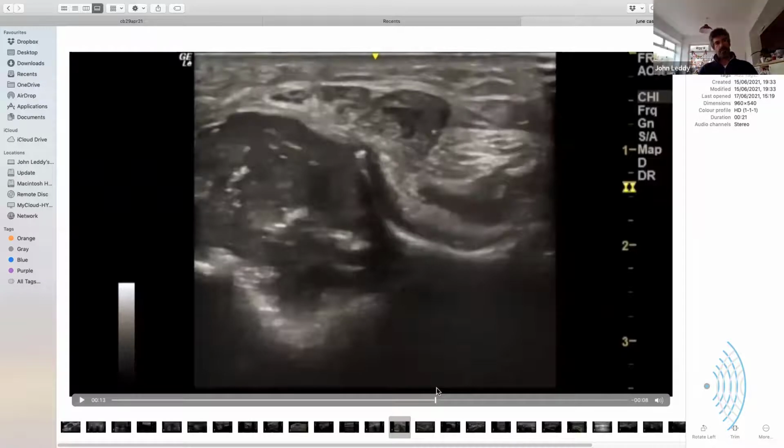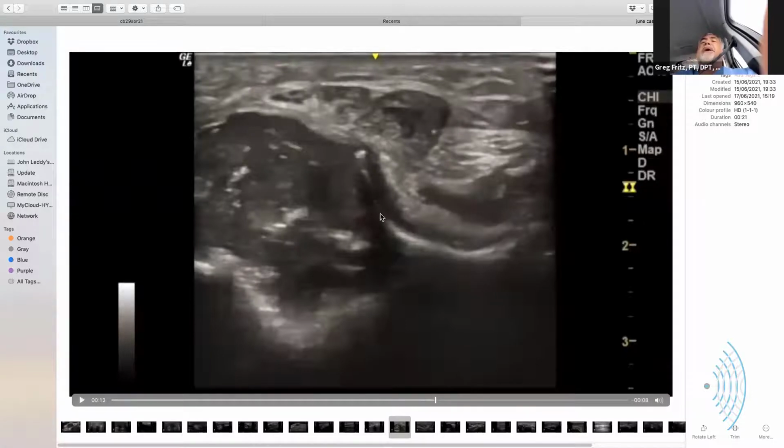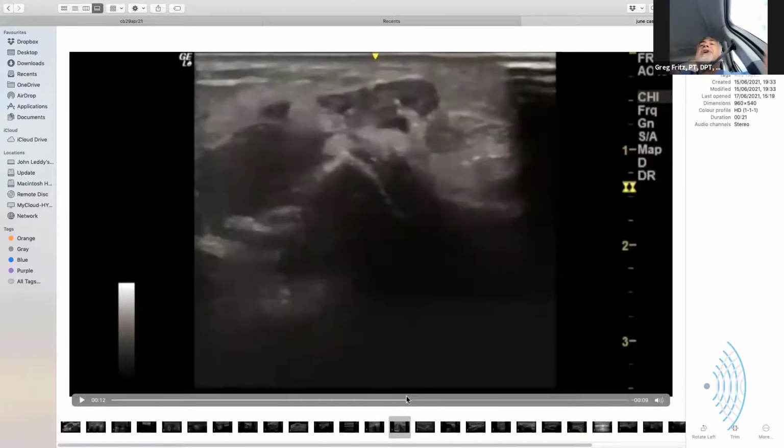So what you're looking at is your eyes are looking for the bright echo texture of the periosteal topography, and you say there's nothing there. There's no cancellous bone. There's no material there, and what we're looking at is a soft tissue with complex material in it when there should be a bony shadowing.